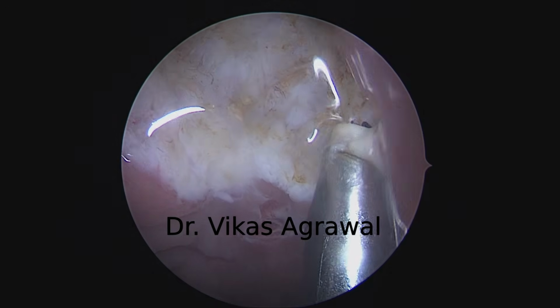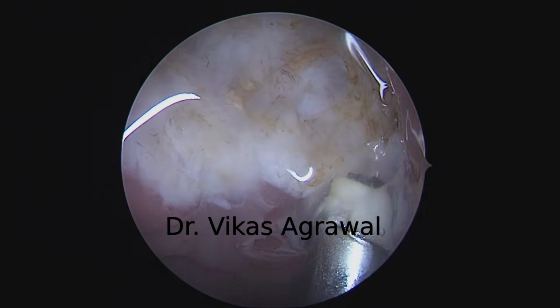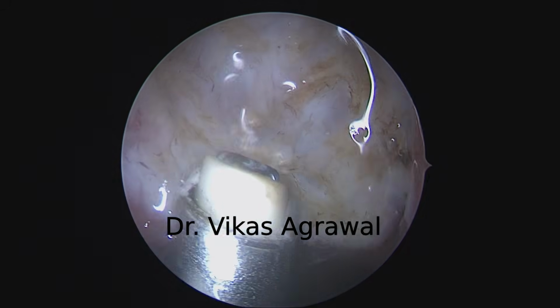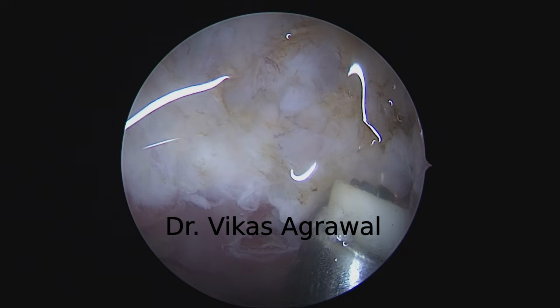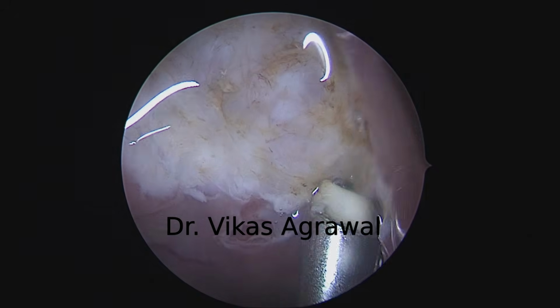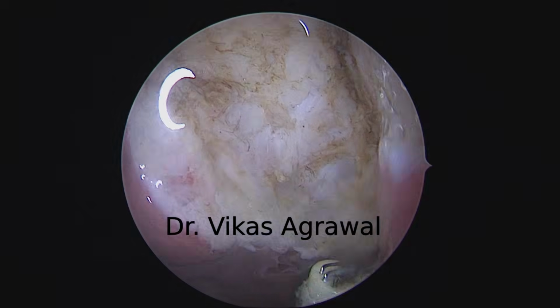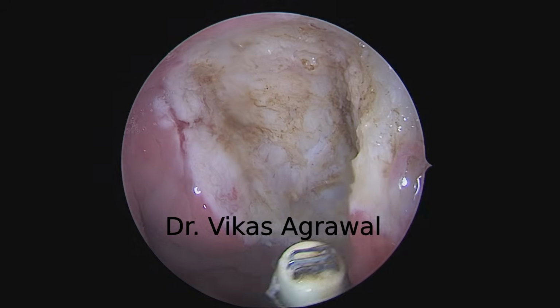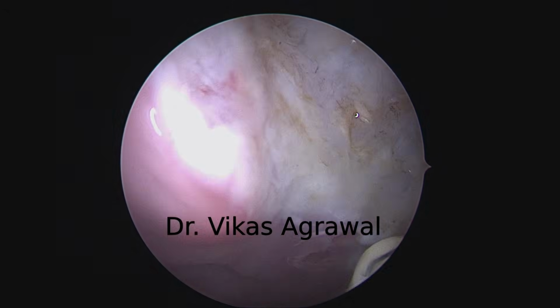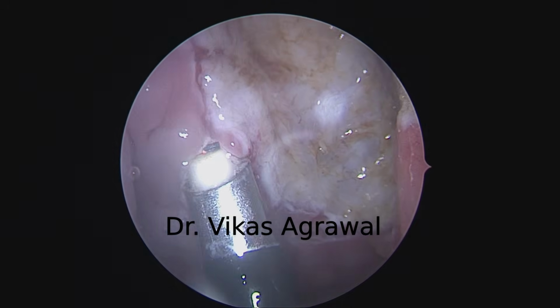When you go laterally, you have to be careful about any vessel which might surprise you. Therefore, I will not do anything blindly. And in the extreme depth, you might coagulate rather than ablating. So this is the boundary of the adenoid on the left side. Now I can see a lot of things from here only. You might have realized that I have not taken out my scope even once so far.